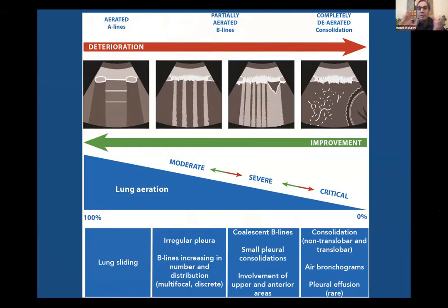I agree from personal experience, but agreement doesn't make it right, because there is no data, there is no study to show yet that the confluent B line necessarily shows more severity. Severity we define by the outcome. If the outcome is not changing, severity is meaningless. I have this picture, you have that picture. So which one of us is right? The question is whether that picture is linked to some finding, some outcome. That's meaningful.